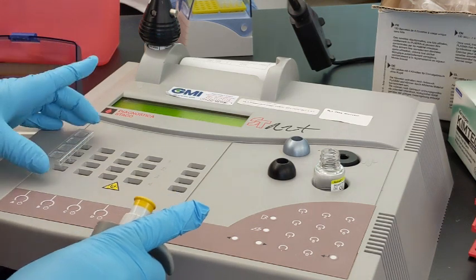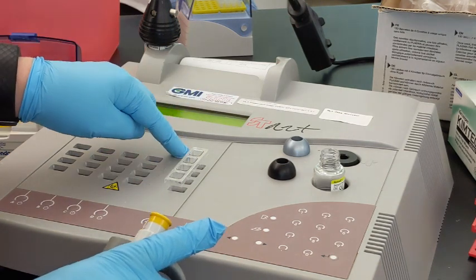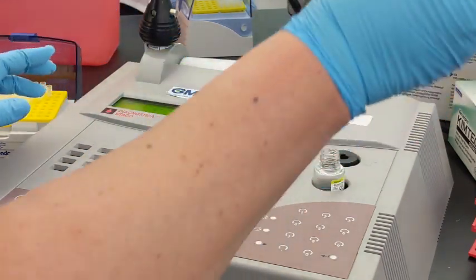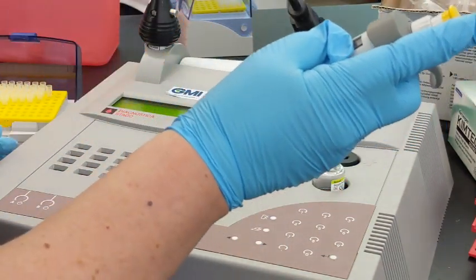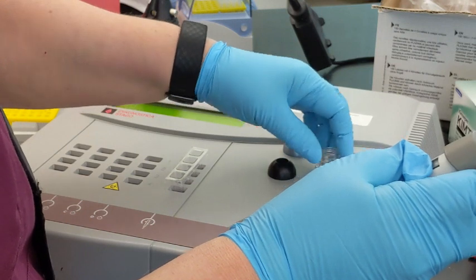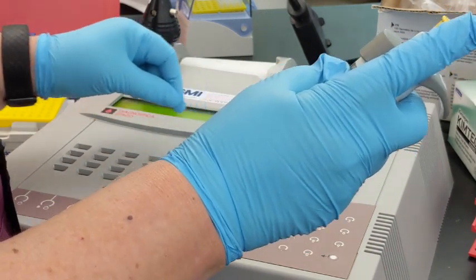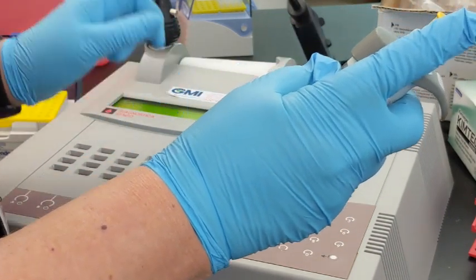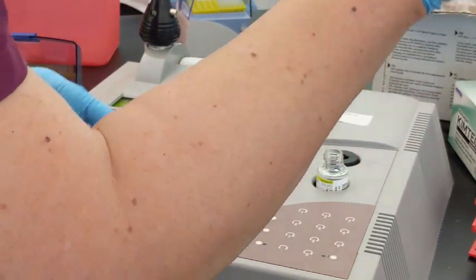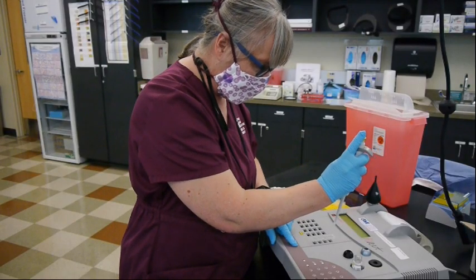So now we can quickly put our cuvette into the test area that is still also at 37 degrees. Some people like to even move it there earlier, but that's how the SOP is written. So now what we're going to do, again, this is the hard part, we're going to now add calcium chloride that's returning the calcium so that this solution can clot, and we're just detecting how long that takes. So we're going to add 50 microliters. Again, this is the hard part. You have to make sure you get a good volume, and then as soon as you dispense it, you're going to push the button.